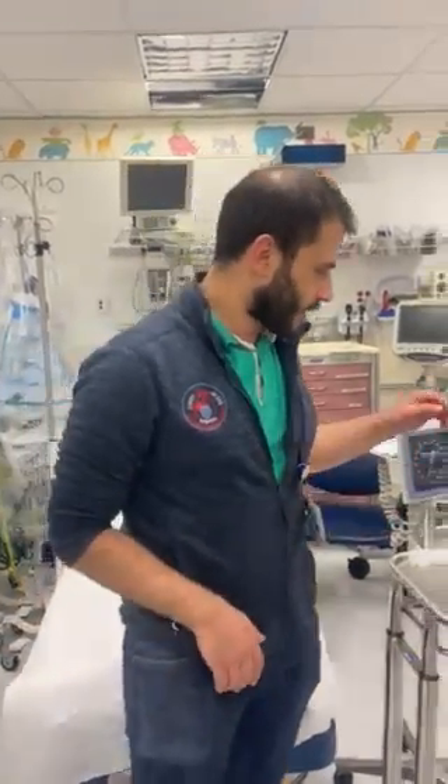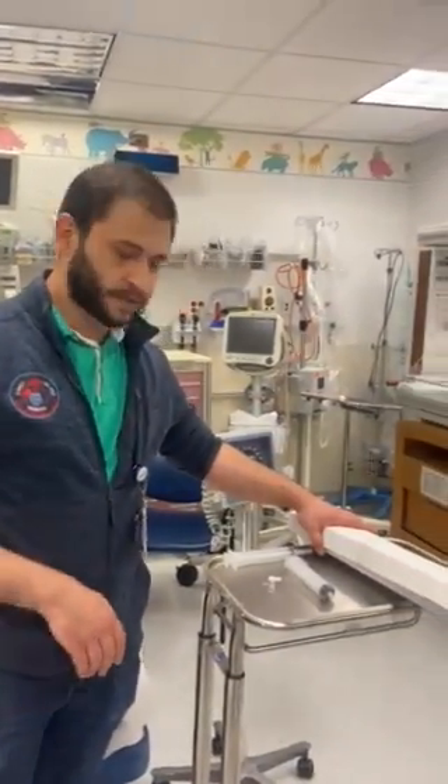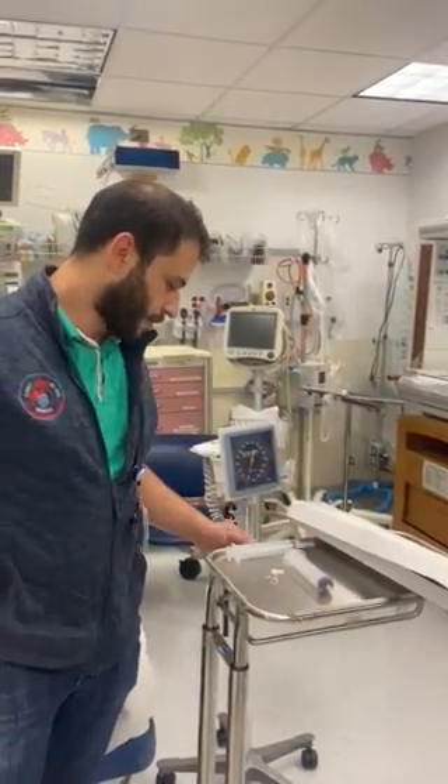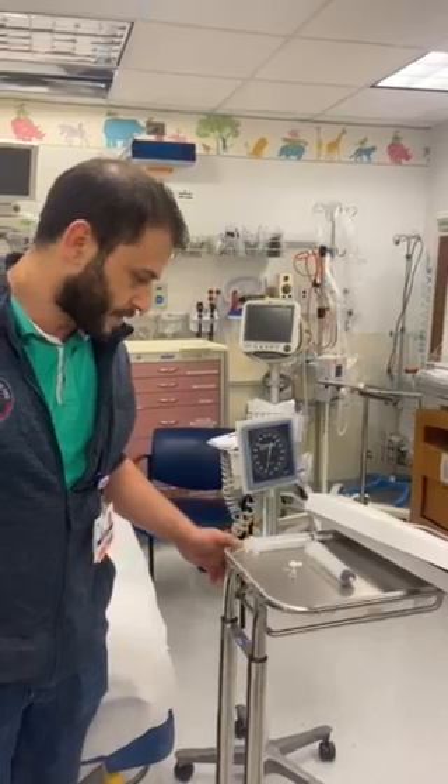My name is Ivan and I'm going to show you how to inflate a Minnesota tube esophageal balloon without a manometer. I'm going to use a manual blood pressure cuff instead.